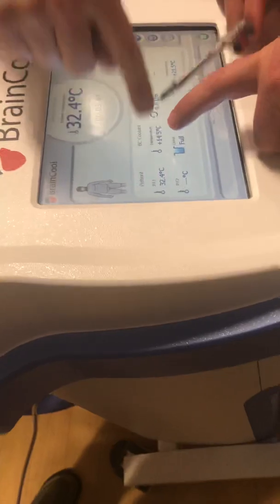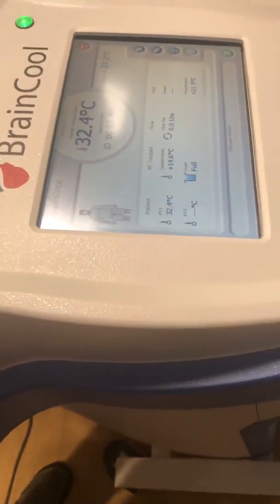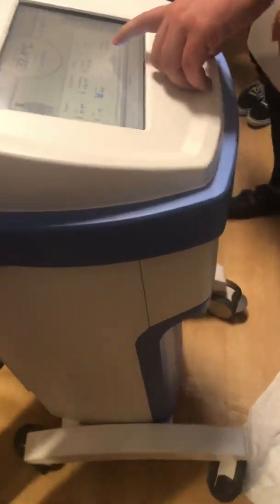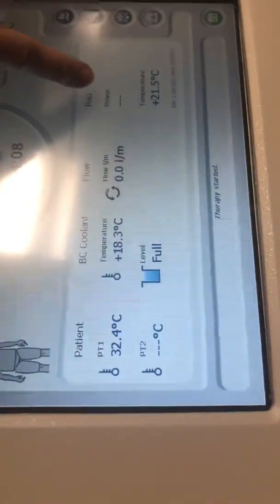And it's measured in watts, you said? It is measured in watts, yeah. So this tank temperature, when you're at target, like 33 degrees Celsius if that's your target, you're going to be somewhere between 28 and 33 degrees as a tank temperature.